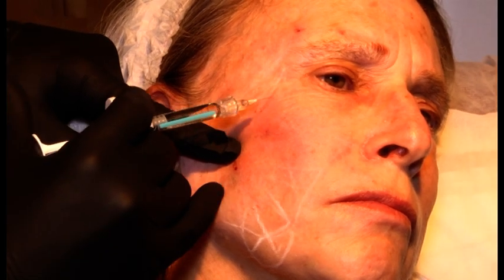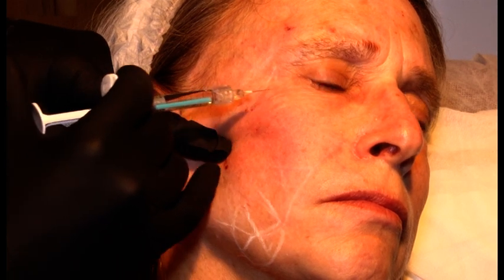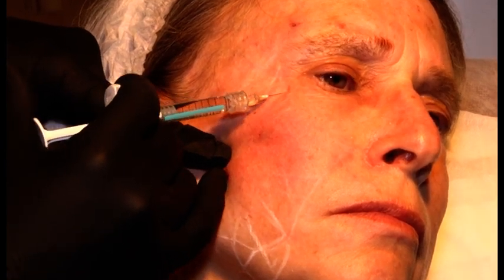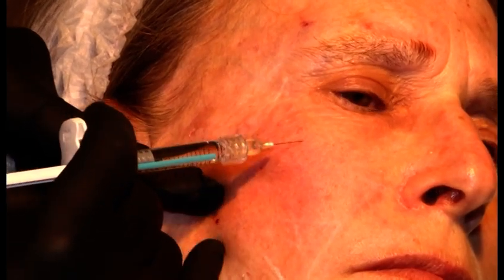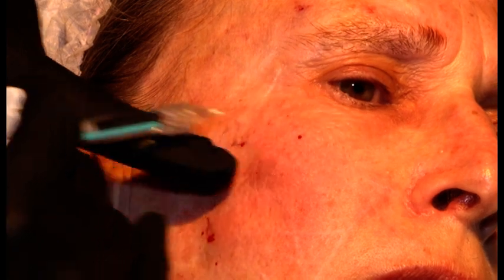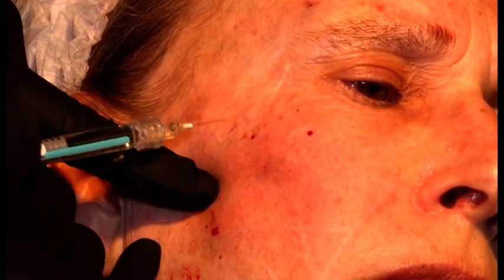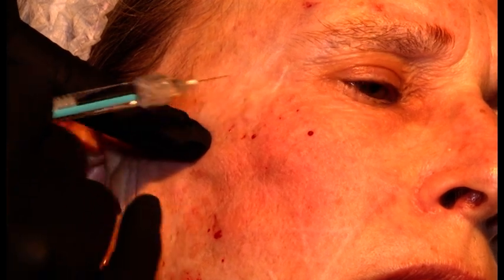And with Belotero Revive, you just put micro drops of about 0.01 or 0.02 maybe. Just small amounts, and as you can see, sometimes you get a little bruise, which is okay, it will go away, they're small.